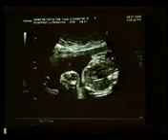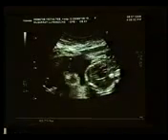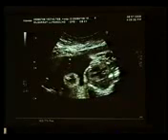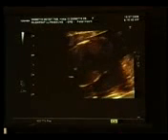So here is the view, and in it you can see what I was talking about. It is thick at the base and thinner at this end, and if you were not in the subcostal view, you will never pick that up. You can measure the ventricles much better in size and compare them with your measurements.